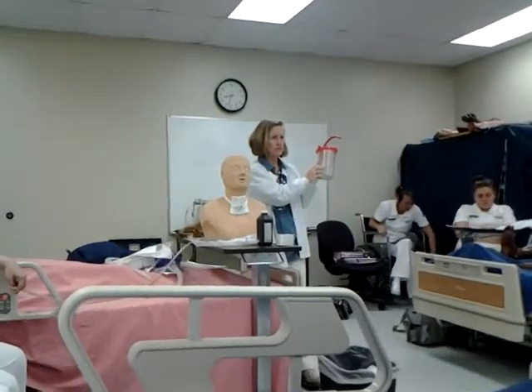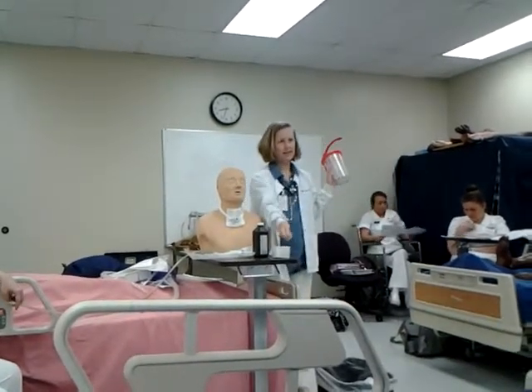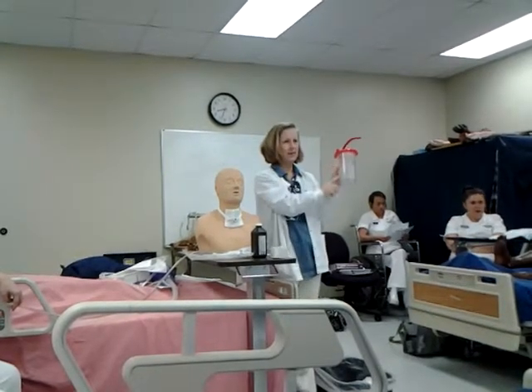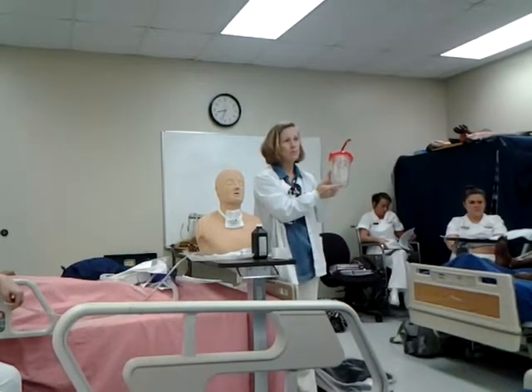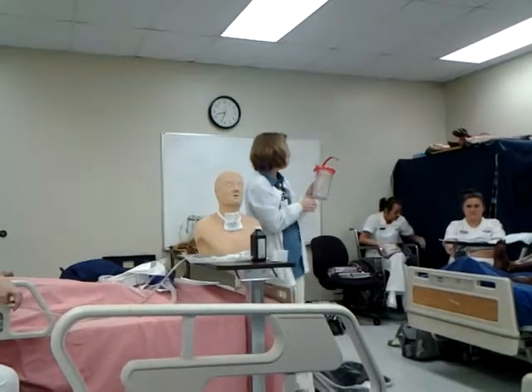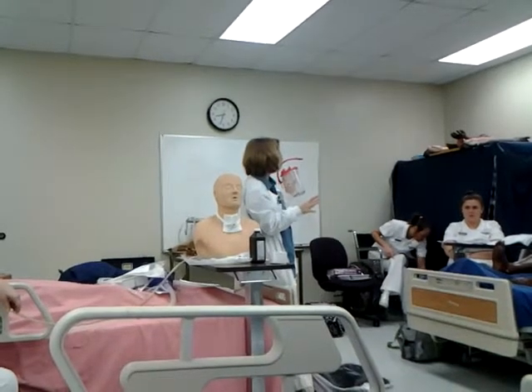So you put the saline in there? Is that what you're saying? Well, because we're using saline, we're sucking the saline to clean our tube, which is ultimately going to come in here. So it can't be all lung secretions. But the saline isn't going to be an accurate measure, though, right? No. Right, you have to kind of guesstimate. How would you document that? You would document it on your intake and output sheet.